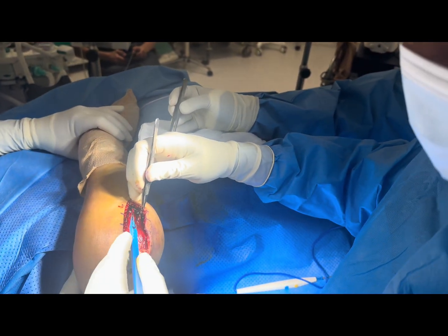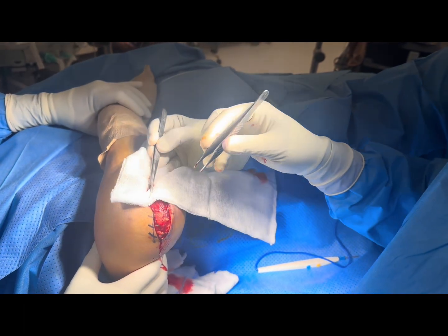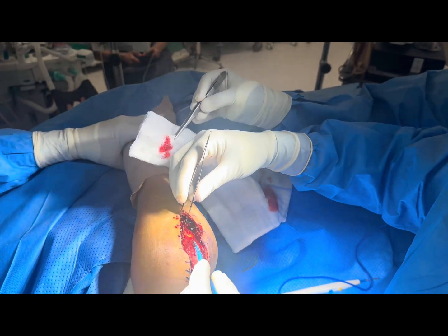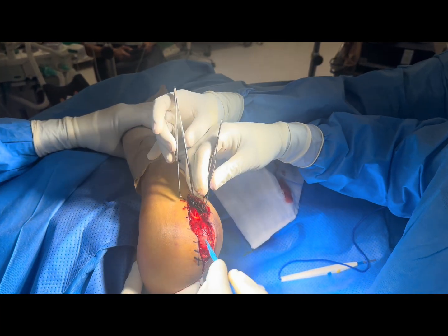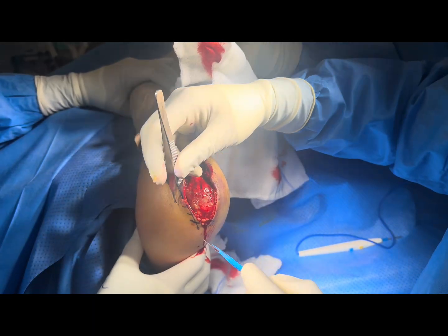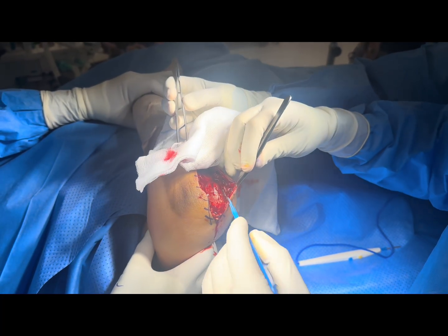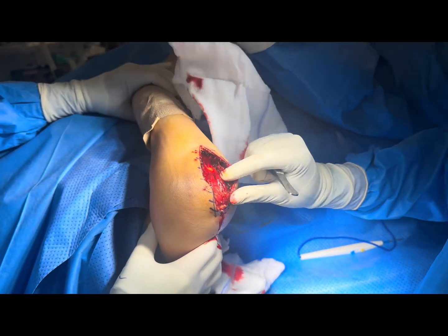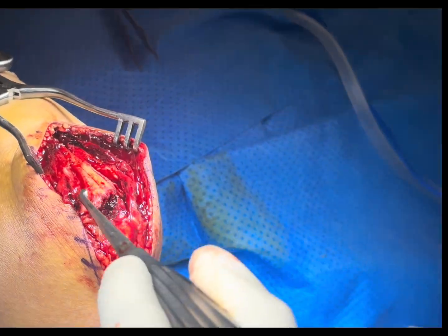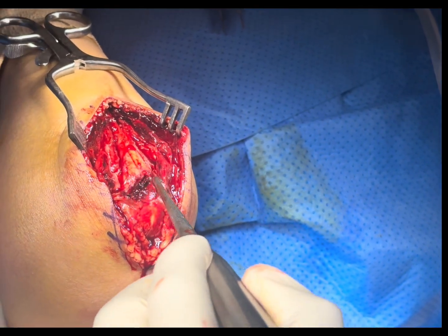You have to create the deep dissections — you have to release the muscles on either side of the ulna. We have created the flap and now we have released the medial and lateral side of the ulna to expose it. This is the fracture site; you can see it clearly here.